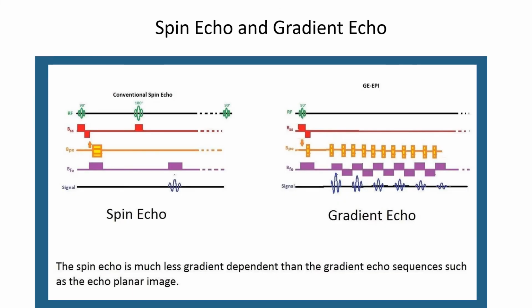Let's see how spin and gradient echo can be used by the technician to reduce worries. A technician can change their settings to alleviate worries about time-varying gradient coils. The pulse sequence that a technician selects can have an impact on these consequences. Because a spin-echo pulse sequence uses RF pulses to excite and refocus our hydrogen nuclei, it is not as gradient coil intensive. On the other hand, gradient echo pulse sequences employ an RF pulse to excite our nuclei but use gradient coils to refocus our hydrogen. In MRI, echoplanar imaging produces the quickest gradient coil activations. As a result, this pulse sequence will have the most time-varying gradient coil detrimental effects.